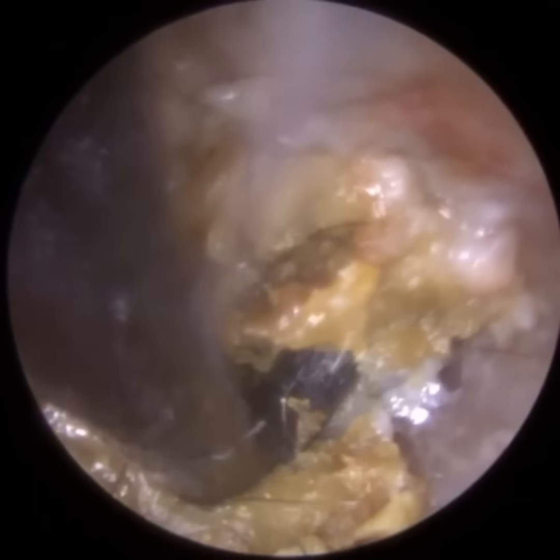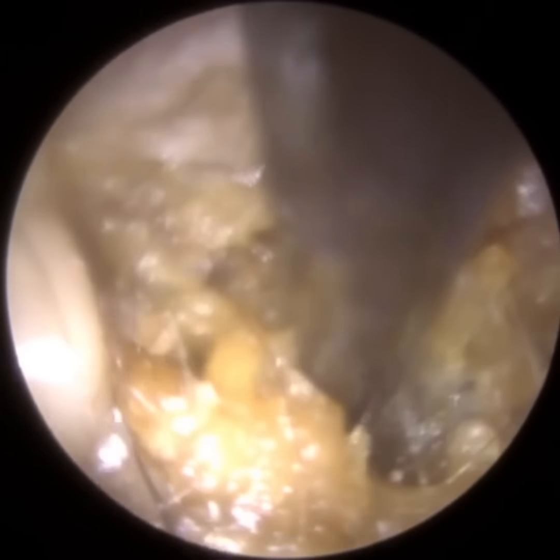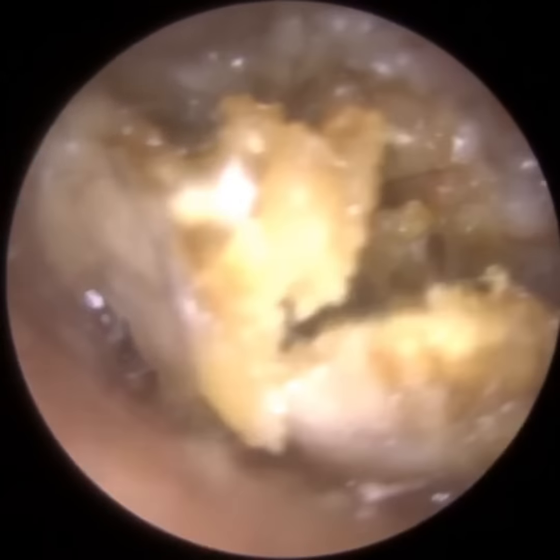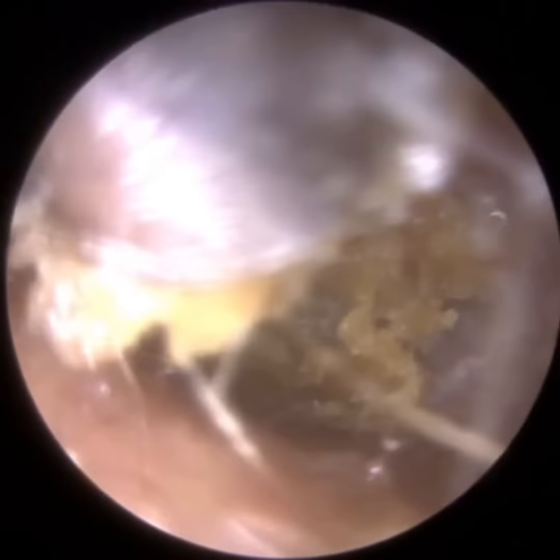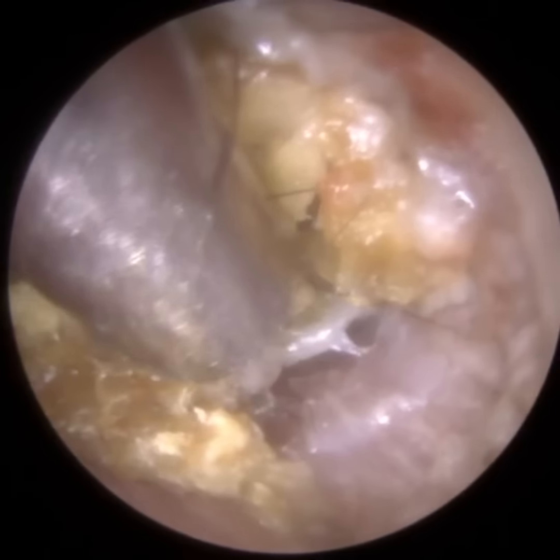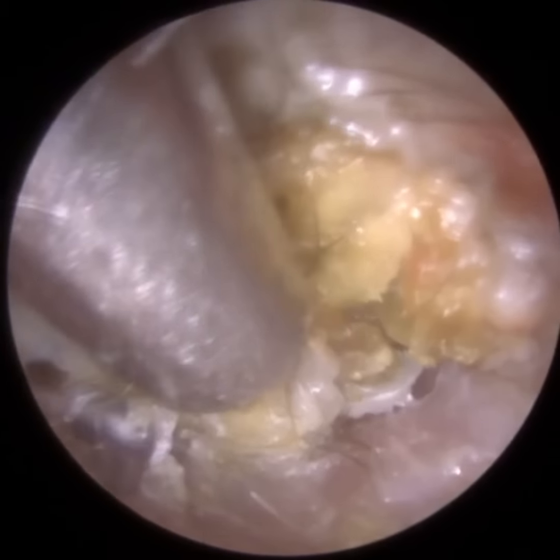So I'm just trying to get underneath the plug into the middle and then rotate, and then I'm going to bring the hook slowly forwards. And I just dissected some of this dead skin. So although it didn't come out, I can now go back in with the Zollner suction probe and vacuum this away. So quite often when you're performing procedures like this, you're using the ENT micro instruments in tandem. You're using one to support another, and you use them in a sequence to help remove the wax. It's not that we're just going to use one instrument, one tool and stick with that.